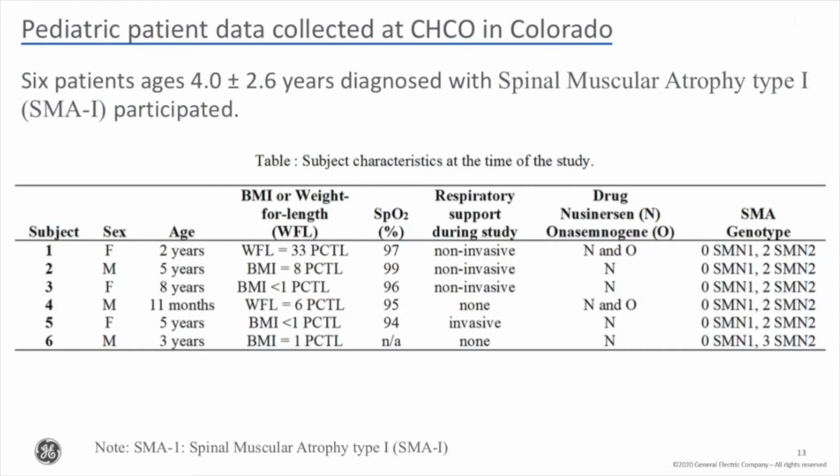Unfortunately, the assessment and evaluation of lung function in children aged 1 to 5 years has been neglected for a long time because of the difficulty of performing forced expiratory maneuvers through the breathing tube. Therefore, non-invasive EIT lung function monitoring might be able to solve this unmet need. There is information on the evaluated pediatric patients in this preliminary feasibility study.